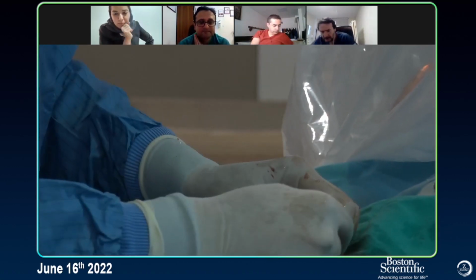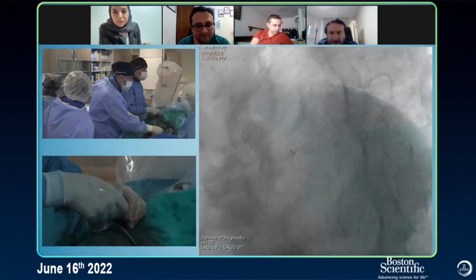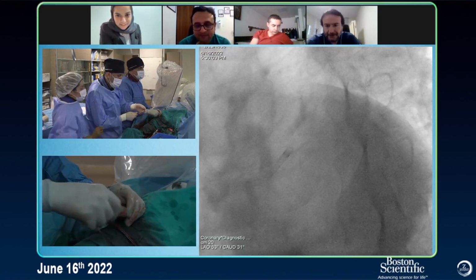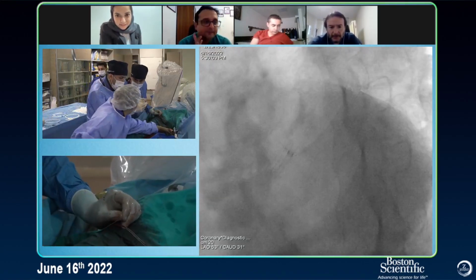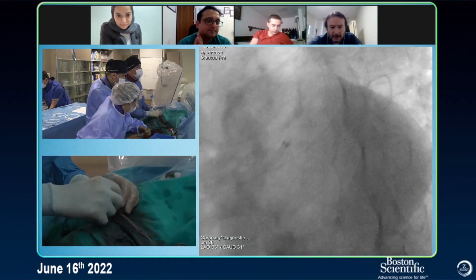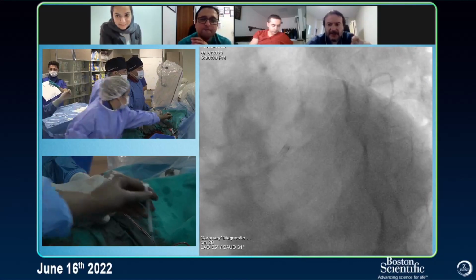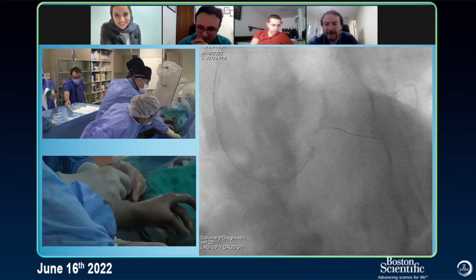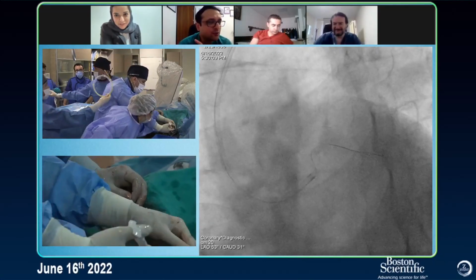Make sure your wire is luminal. Yeah, exactly. I fixed the LAD in that. Fresh wire, good wire. E-tel means expensive wire in Turkish. E-tel, expensive wire. So just one suggestion, do you want to consider giving some heparin bolus here?